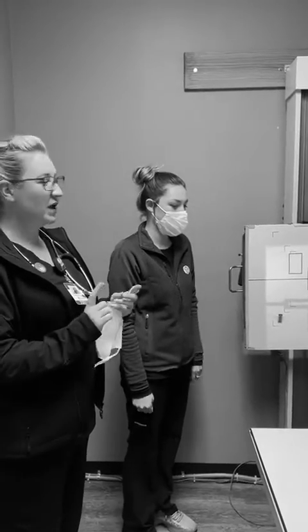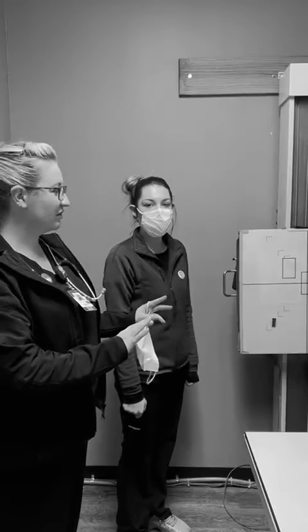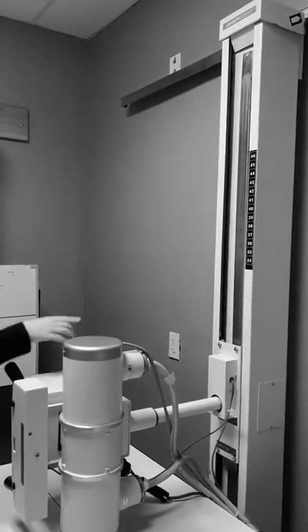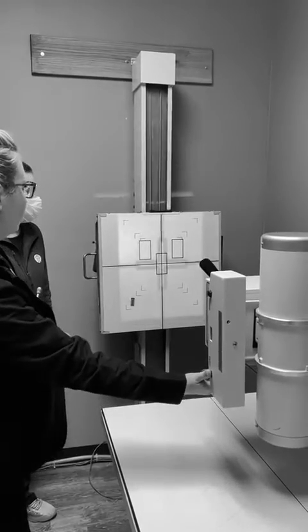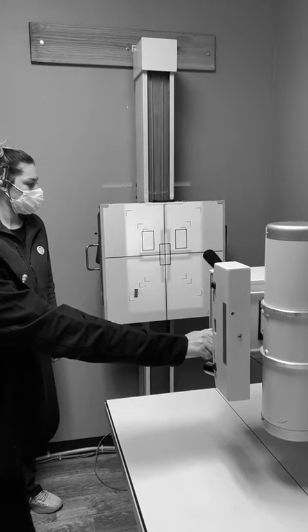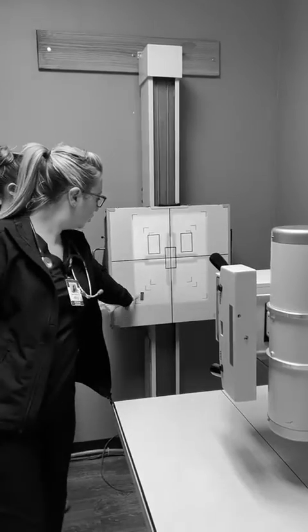We're doing an upright abdomen and a KUB. First I like to start by setting everything up. You're at 40, so bring this into 40 here. And then I make sure everything's lined up, that we don't have light all the way out here — just the length of the board. And I've already got my marker over here.